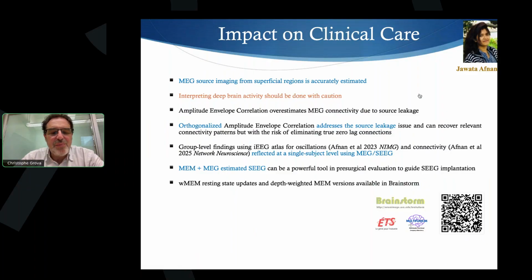SEEG implantation requires a huge knowledge and you have targets. But when we know what is the target we want to reach, probably this technique might tell us, okay, do perhaps a bit more data orientation, and you're going to cover a bit more accurately the extent of the underlying generator. So replacing SEEG, I don't think so, but improving the chance of succeeding in SEEG and improving objectively the implantations, I think yes.